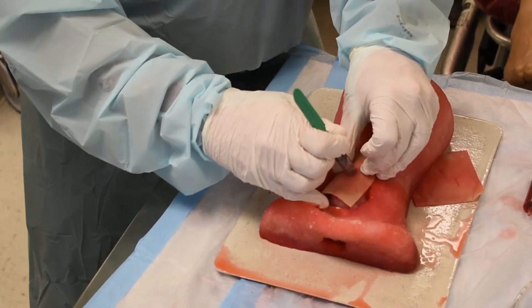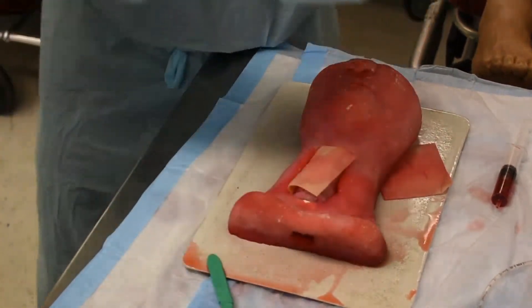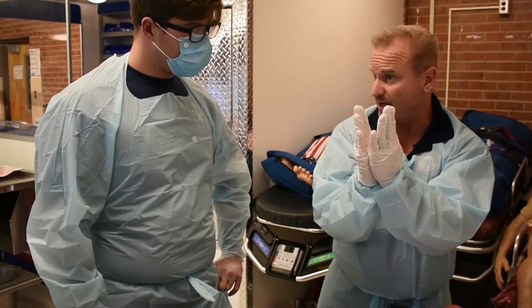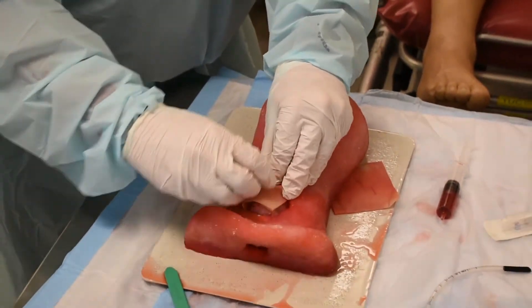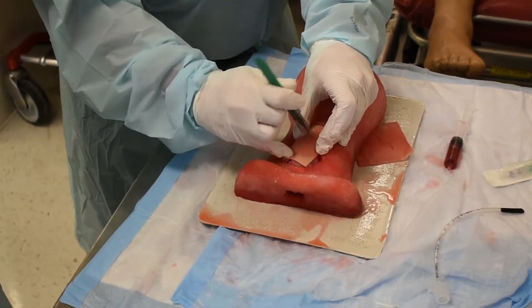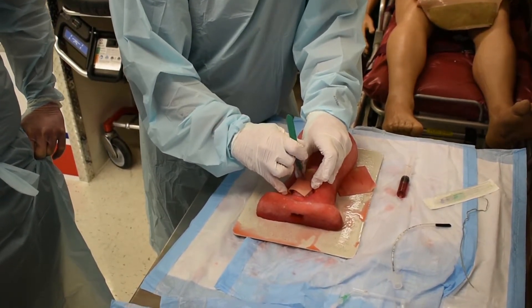I make my incision. As I make it, I'm spreading that skin and it's going to open up. There is going to be blood, and that is okay — blood works as a great lubricant. Once I spread the skin, I want to find that cricothyroid membrane. If it's too bloody, just take your 4x4, blot, blot, blot, and then make that incision through the cricothyroid membrane.